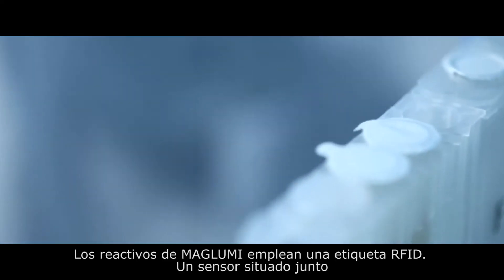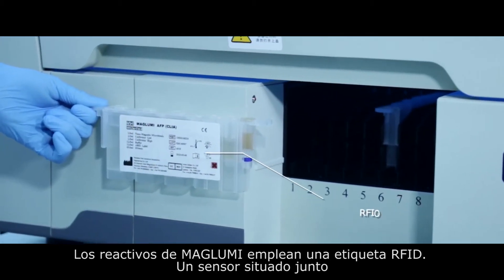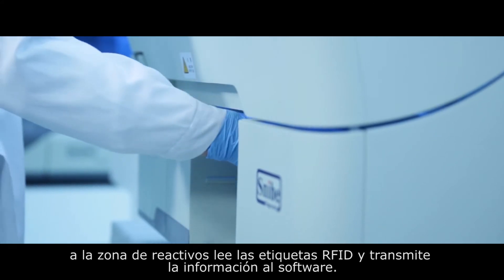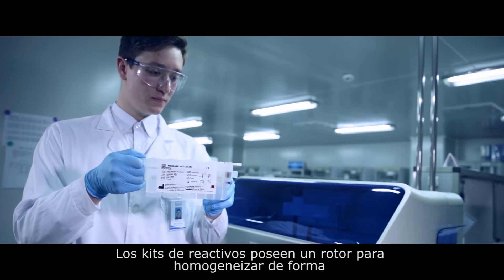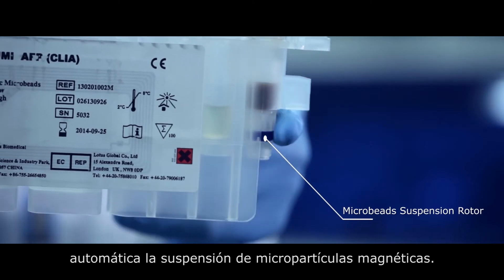The Maglumi kit uses RFID technology. Next to the reagent area there is a sensor which automatically reads chips on reagent packages and passes all information to the software. With Snibe's bead technology, there are more than 120 kinds of reagents available for selection.